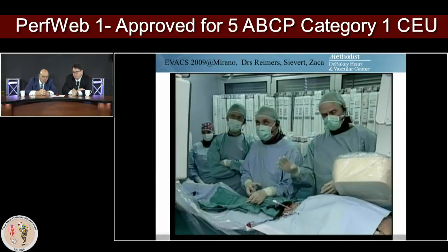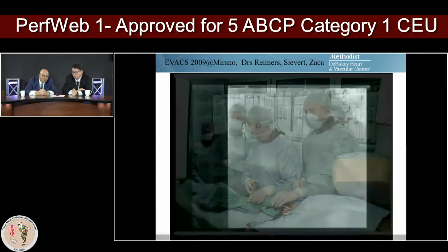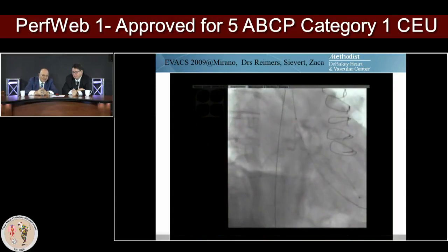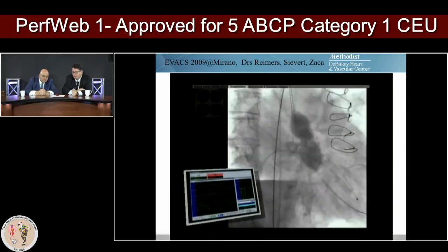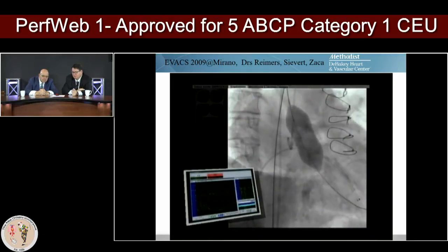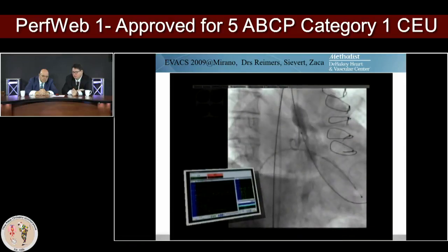So this is not that lucky a moment, because this is another balloon valvuloplasty you're going to see. And in this moment, you have a balloon going up. You're at 200 or 160 or? And after the balloon is deflated, you do not see the heart start beating again.